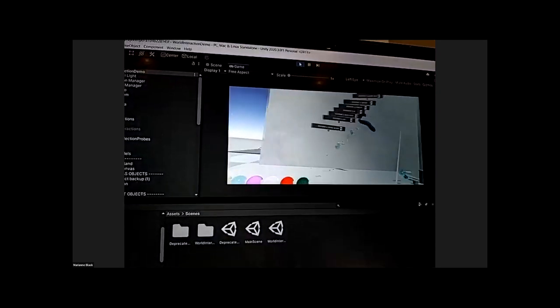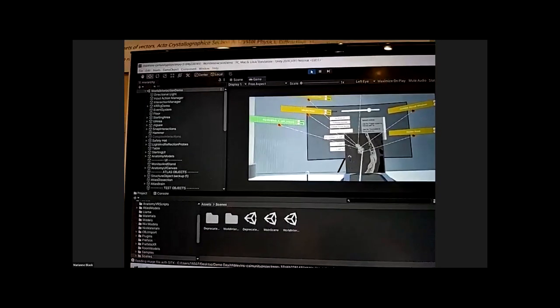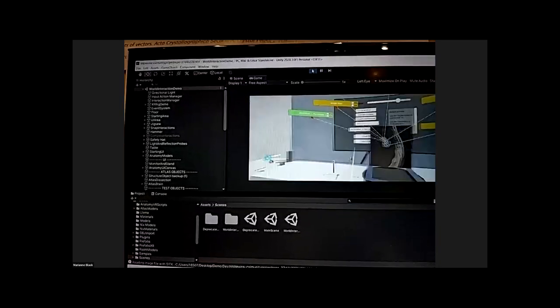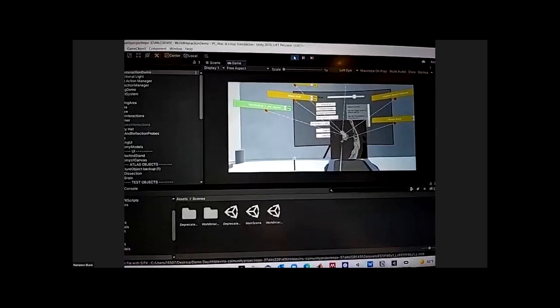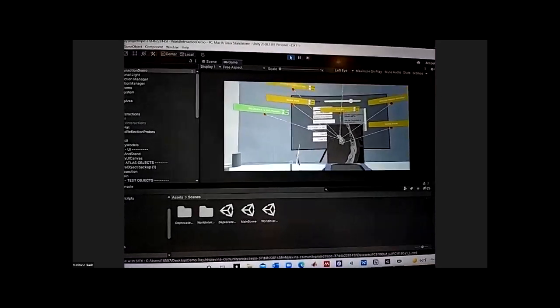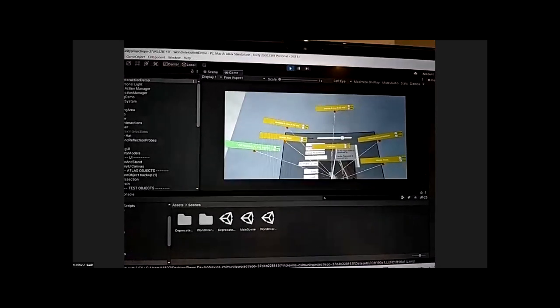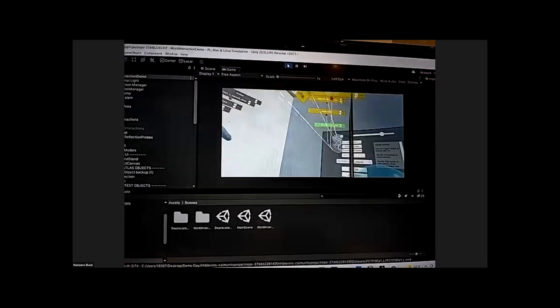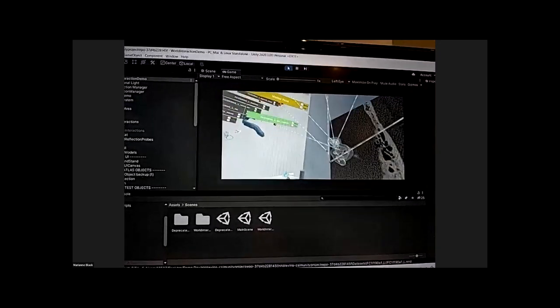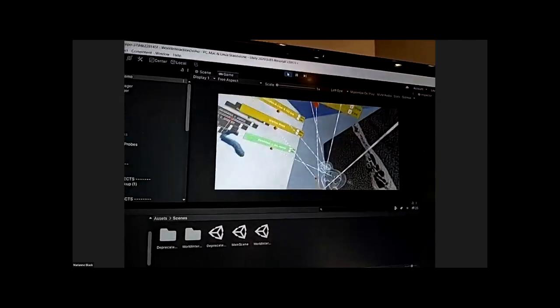Okay, it could be this one. Let's try. Okay, exactly. So this wand allows you to find the distance between these two markers that you just put. And then you can also grab it, bring it back closer, and look at that again. And you can put these markers wherever you want on the anatomy and try to analyze and get certain dimensions that you would need in surgery.